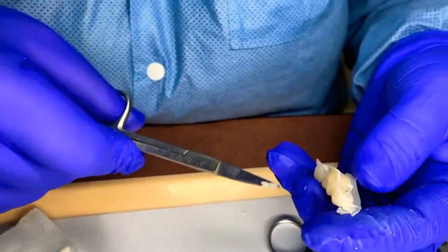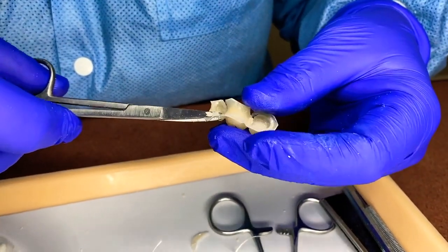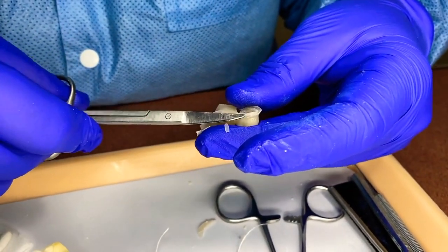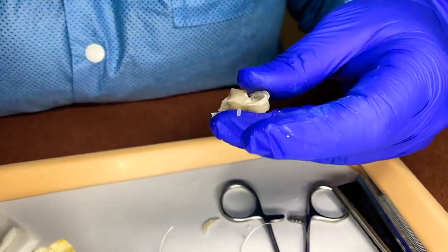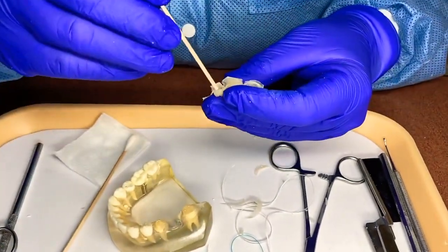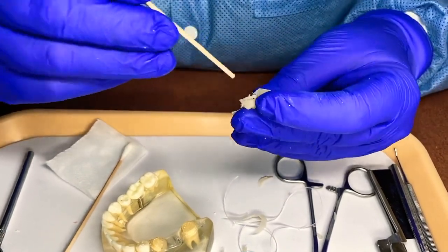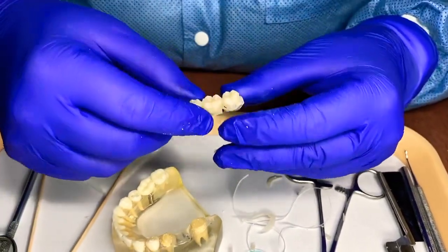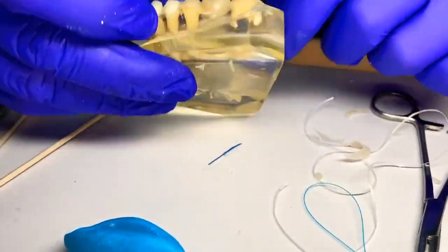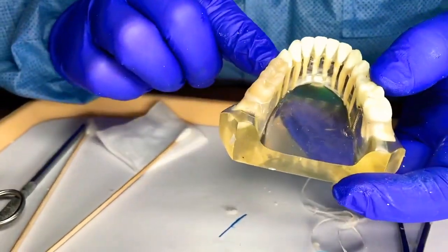Cut around everything and cut that excess off — we don't need it. This cuts really easy and makes adjustment a lot easier when you don't have all of this excess material. Make sure nothing's inside it — when you put it back on, it should seat properly. Place it back on and there's our bridge: 18, 19, 20. Now we just have to adjust it.